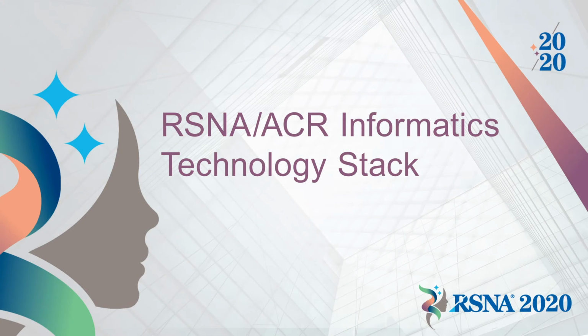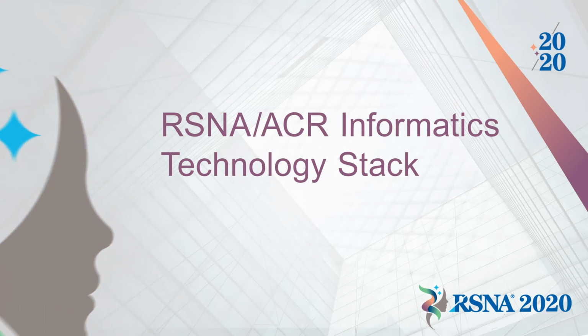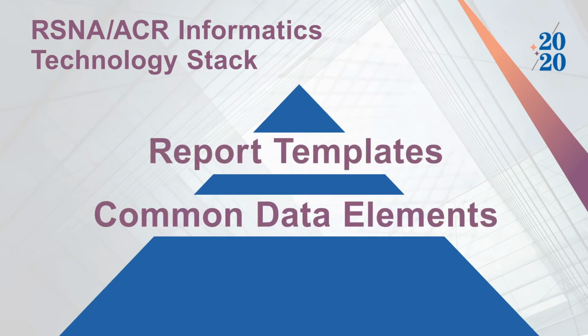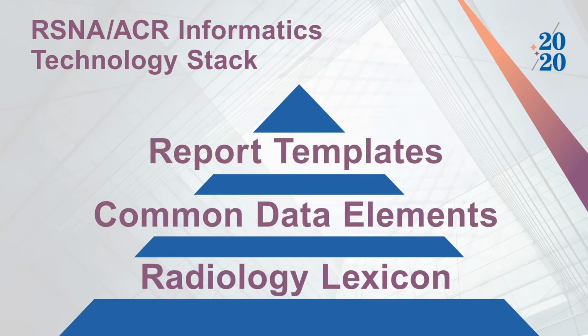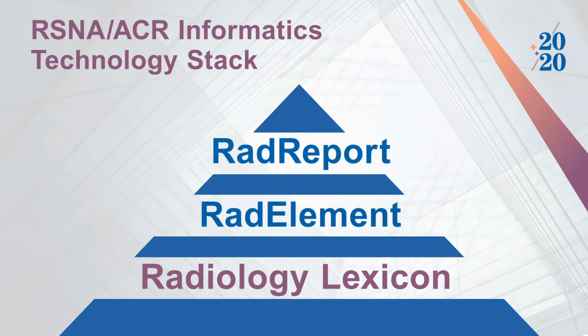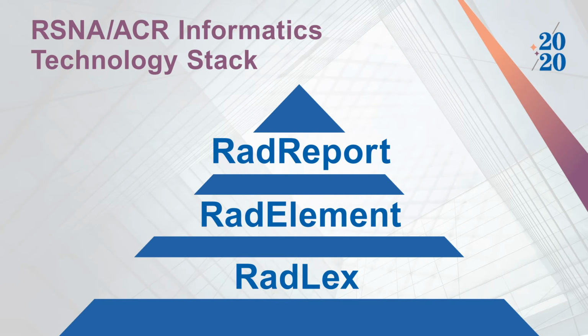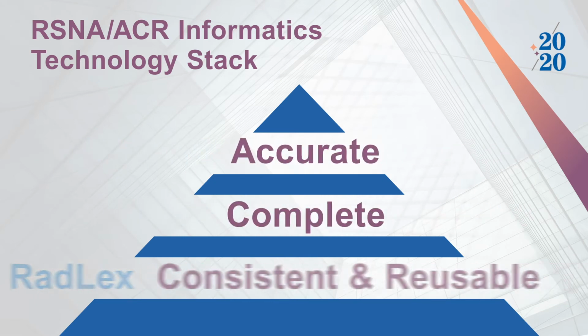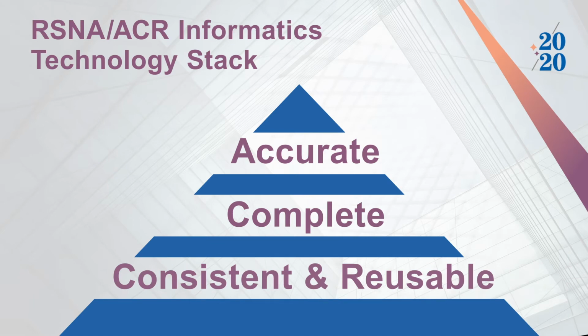The RSNA ACR informatics technology stack consists of report templates, common data elements, and a radiology lexicon, respectively named RAD Report, RAD Element, and RAD Lex. Using these building blocks ensures accuracy, completeness, and consistency. These building blocks are usable between modalities and regions of the body.